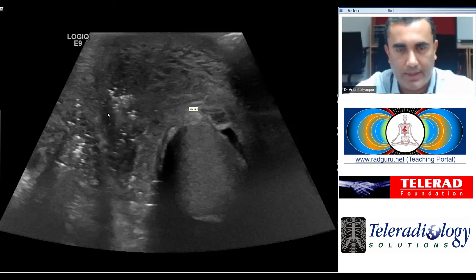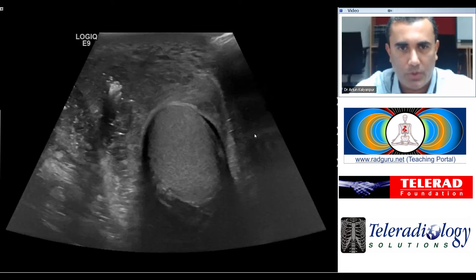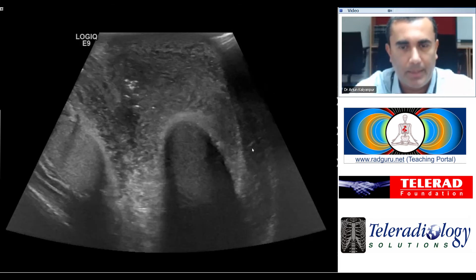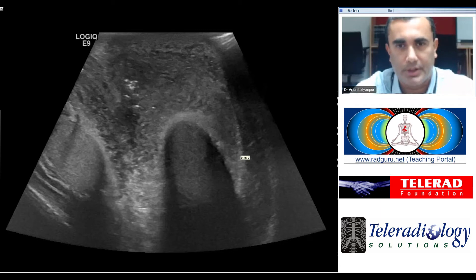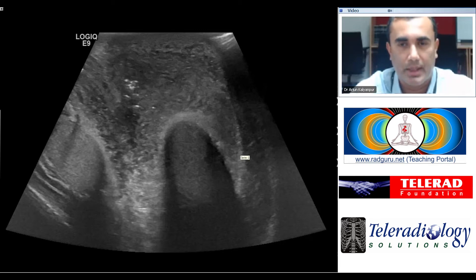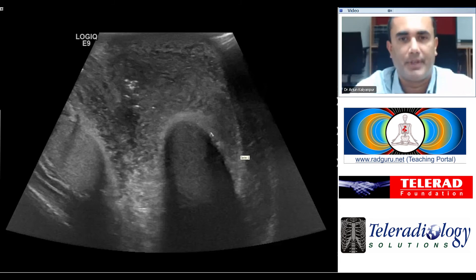What would be the reason for air in the scrotal wall? In a patient with an inflamed scrotum that is edematous, red, hot to touch, and a patient who is sick with an elevated white count, the obvious concern would be for Fournier's gangrene, which is an anaerobic infection or cellulitis of the scrotum.